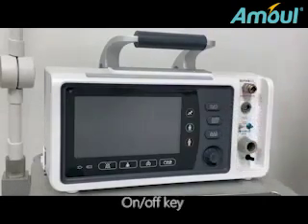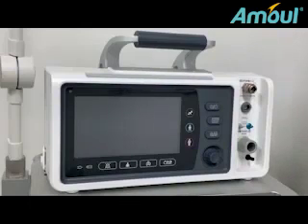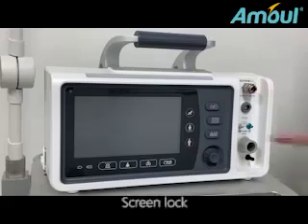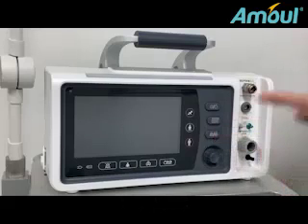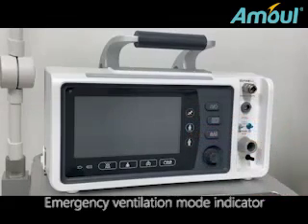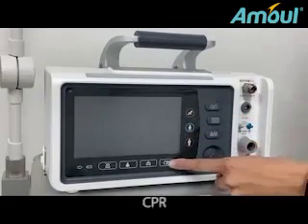On-off key. Main menu. Screen lock. Emergency ventilation mode indicator. CPR.